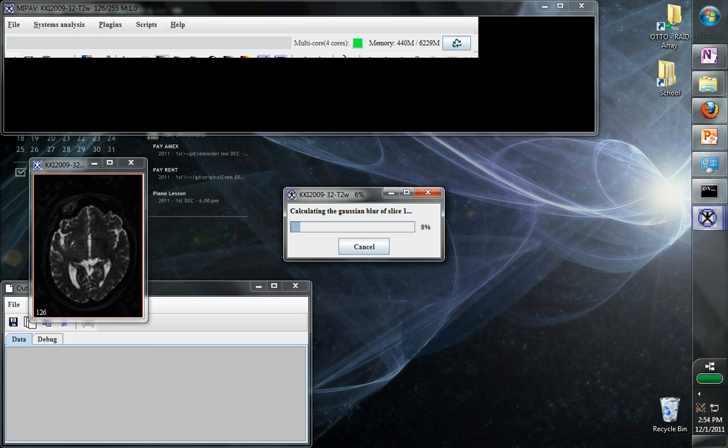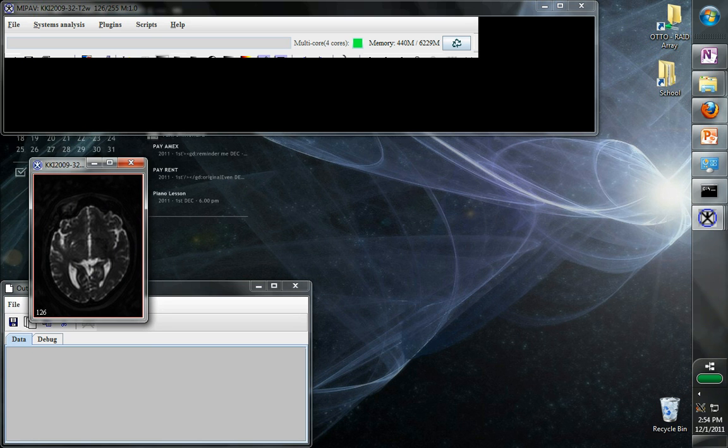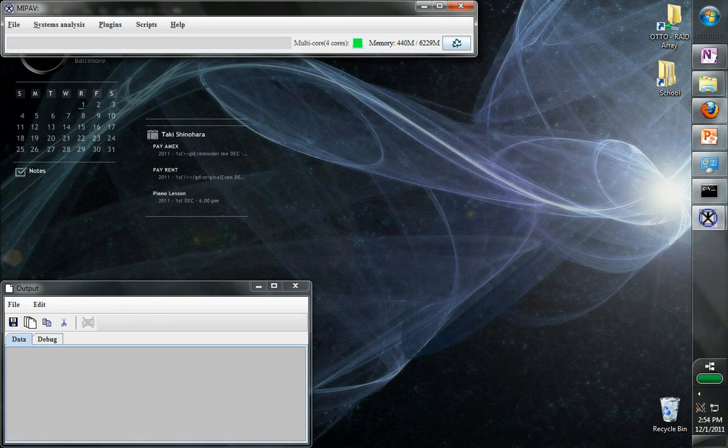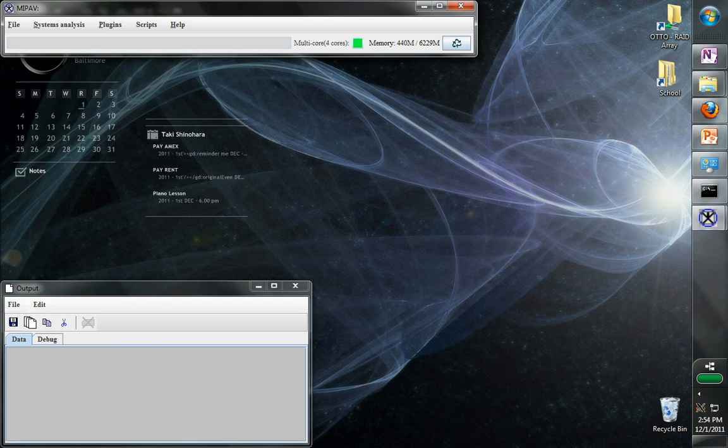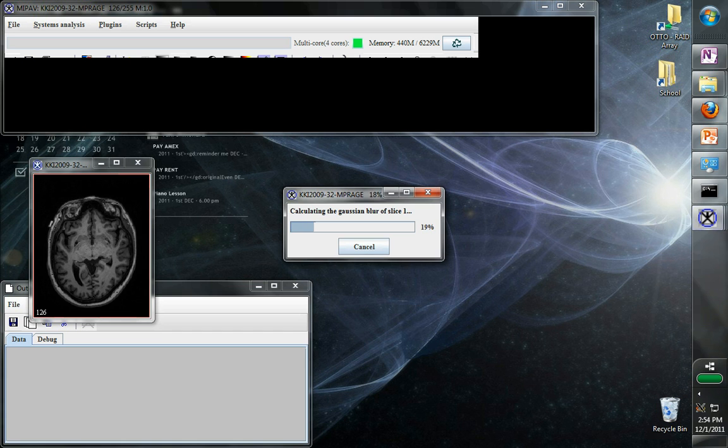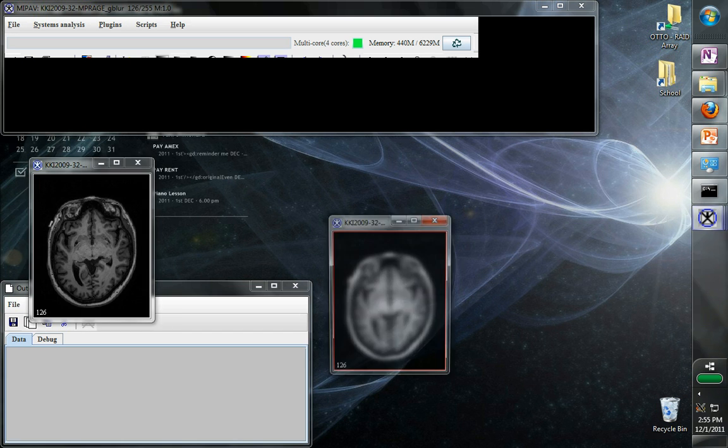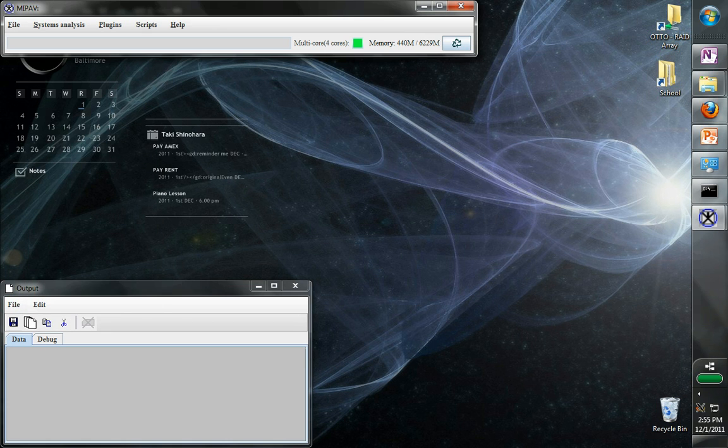Here it is. MiPav has opened the T2. It's blurring it. We see the blurred image, and it closes them. The T1, same thing. Blurs it, and then closes it. And we're all done.